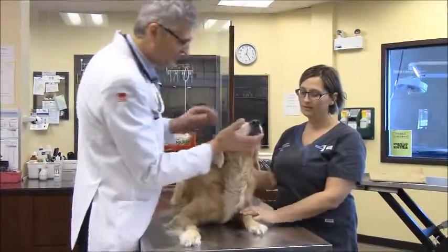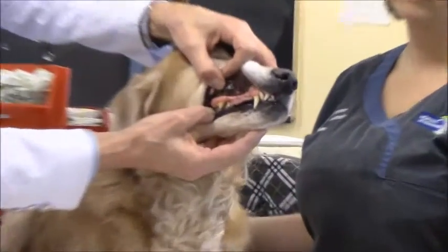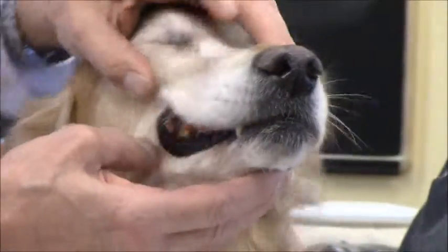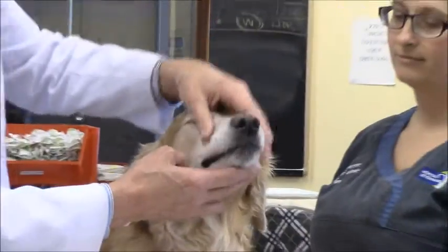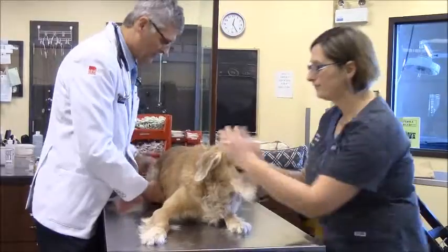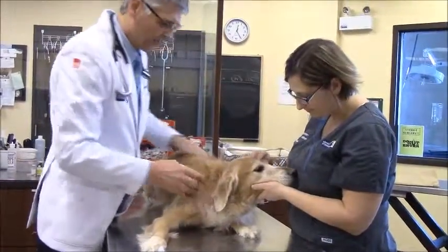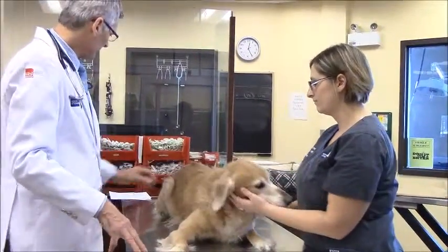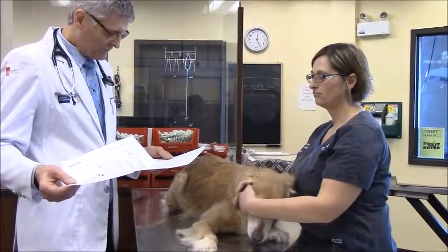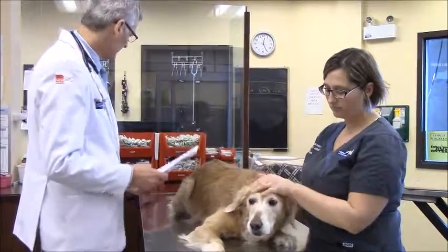I'm Dr. Viranowski. As you can see Ruby's teeth, she has tartar and her gums are swollen. She has grade 2 disease, so it's still 100% reversible — we can fix everything. I'm going to do an exam: check her lymph nodes, her heart rate, her respiration, make sure that everything is okay. After which we're going to give her a sedative. We did do a blood test about a month ago — a complete CBC and 17 biochemistry parameters — and everything was within normal range in preparation for today's anesthesia.